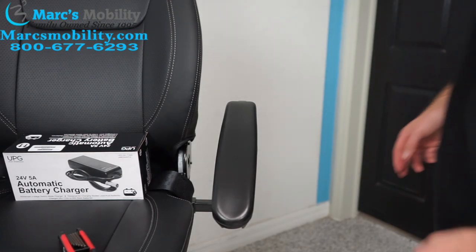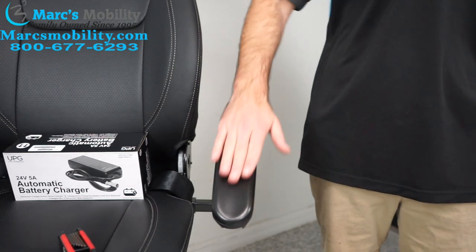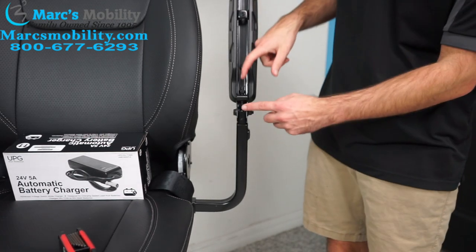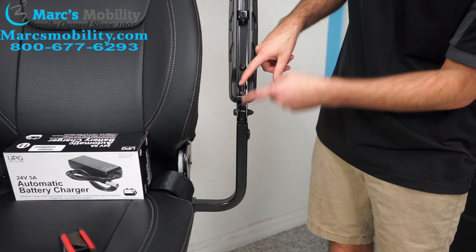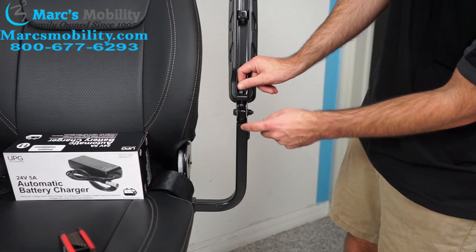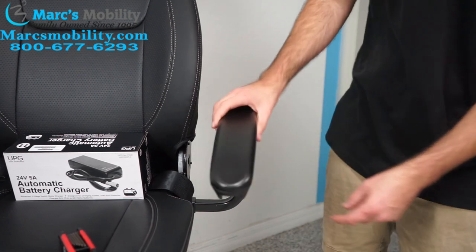The next adjustment we can make is changing the tilt of the arm. You can see how this arm is tilting downward. If I want the arm to sit more level, what we would do is loosen this screw here. There is this screw and then a little nut — you want to loosen the nut, and then if you unscrew the screw down, it'll hit this plate, and then the arm will start sitting higher.